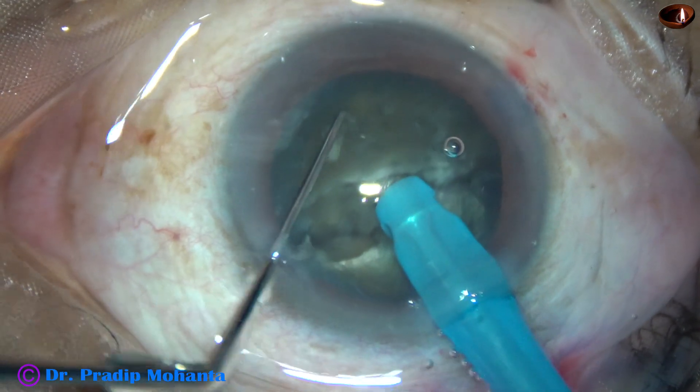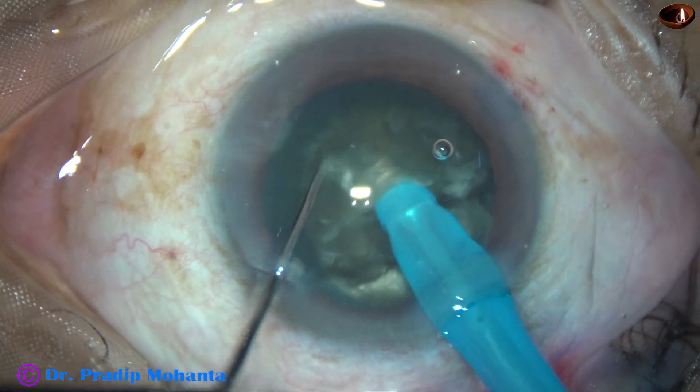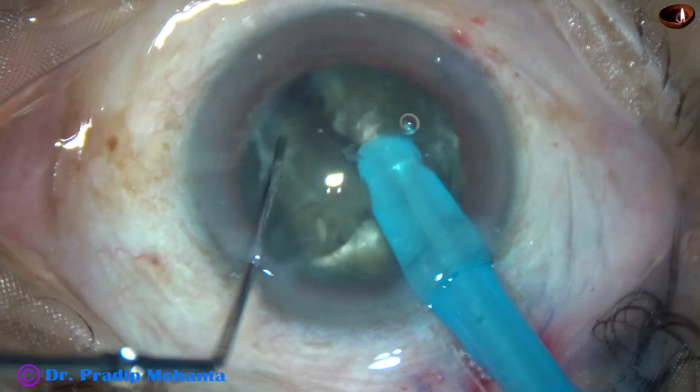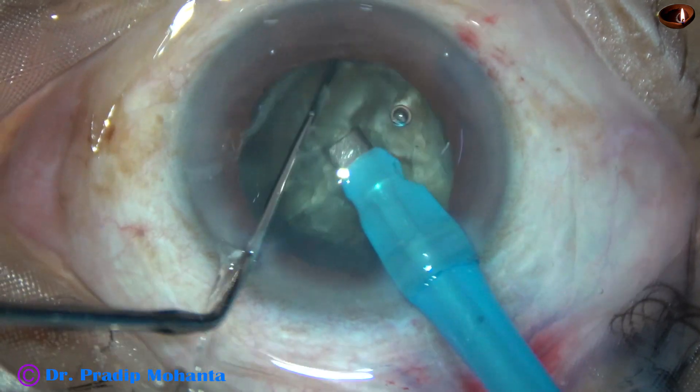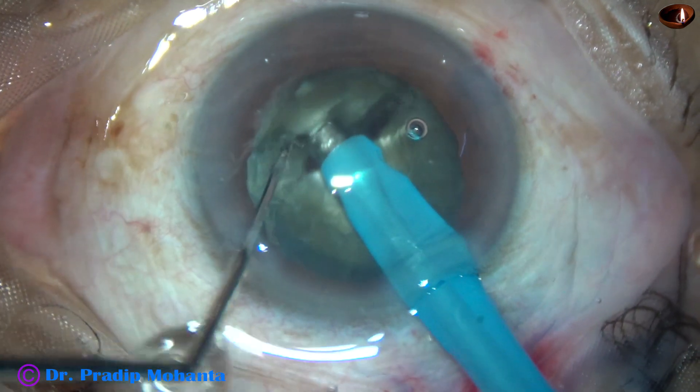So even in this hard cataract we don't have to make a trench. This submarine chop technique can do the job without making a trench.